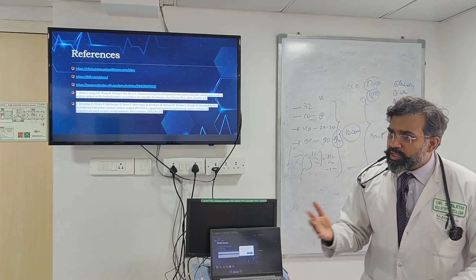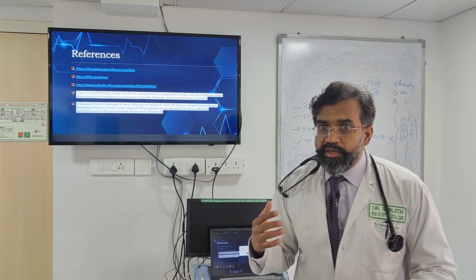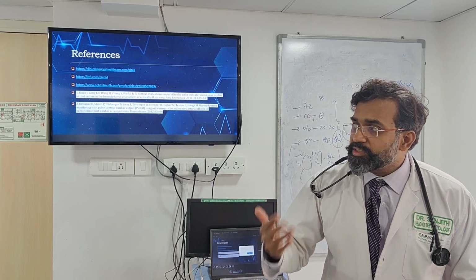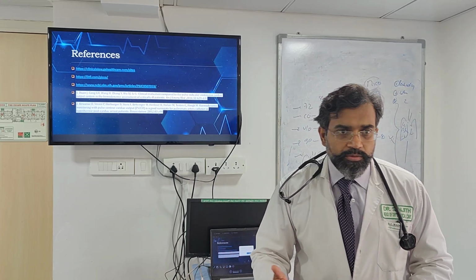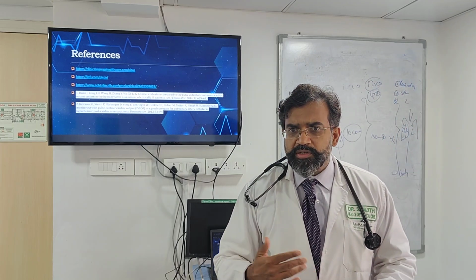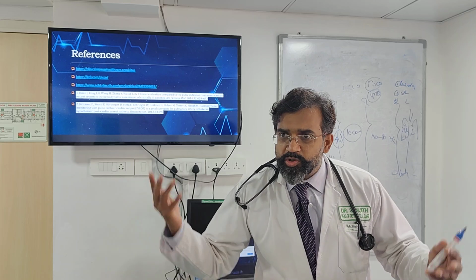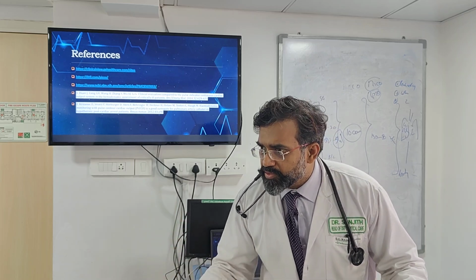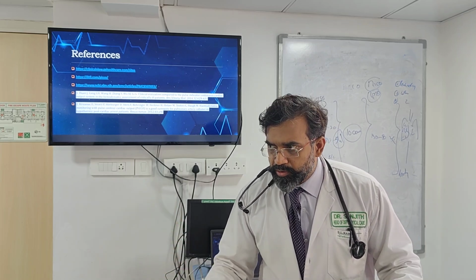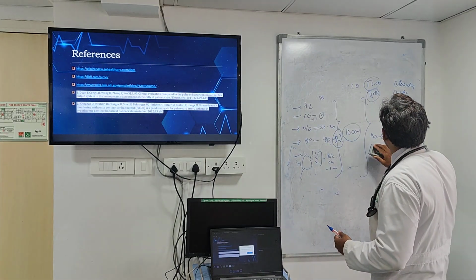Similarly, which other patient have we done it for? What do we do there? We kept giving fluid to resuscitate based on Picco. We resuscitate based on Picco, to an extent that we started with this resuscitation, urine output came. Whether it's going to improve, time is going to tell, but we did the right resuscitation based on a Picco monitor. These are two examples of what I've tried to tell you.